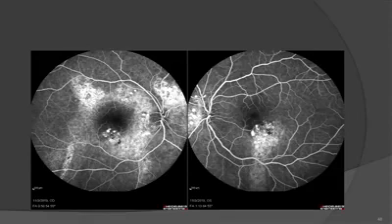When I did fluorescein angiography, I found multifocal leakage, especially near the optic disc. So I gave him a course of prednisolone tablets and there was some resolution, but not much. Do you advise micropulse laser for patients with uveitis with chronic CSR, and which machine is good for micropulse laser, and is photodynamic therapy available in Jordan or not?